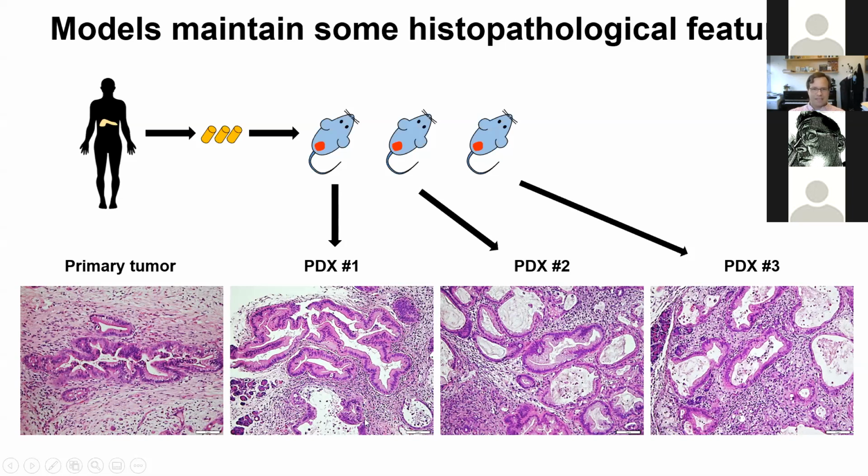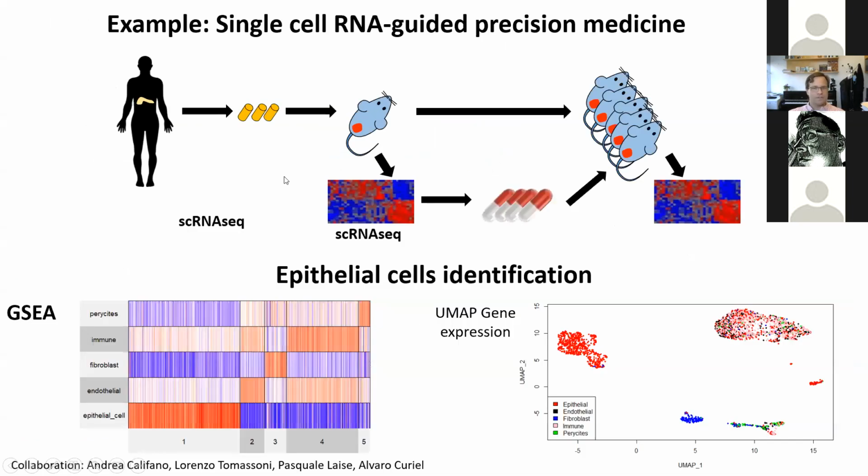You can see, even just histopathologically, that the stroma is looser and more hypercellular than the original tumor. So there are going to be similarities and distinctions on every single tumor, and that's why it becomes important to do the molecular profiling of the tumors that come out, so that we can determine just how close the established models are to the original tumor.